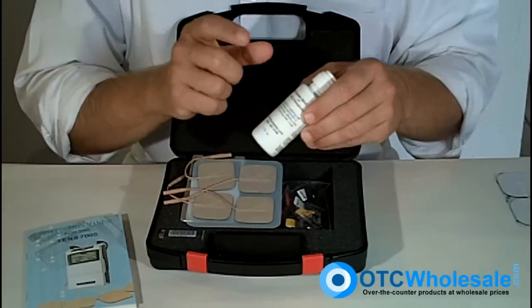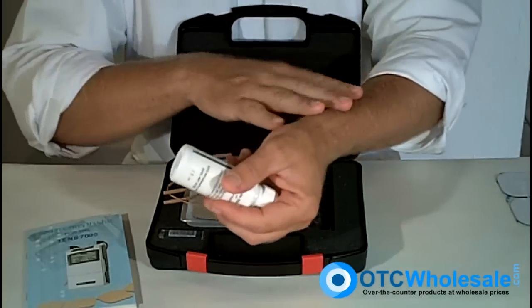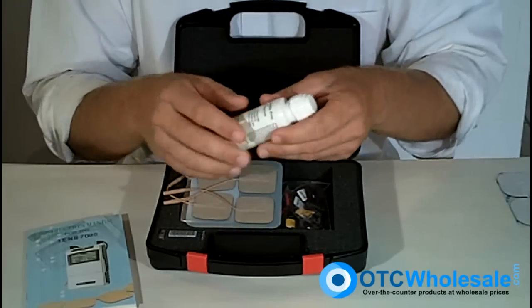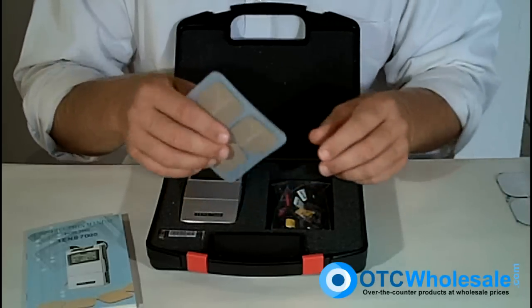Also, get yourself some skin prep with antiperspirant on it. You put it on the area — it keeps the area dry, gives you better connectivity, and increases the life of the electrode. Those two accessories are absolutely invaluable. Can't stress that enough.